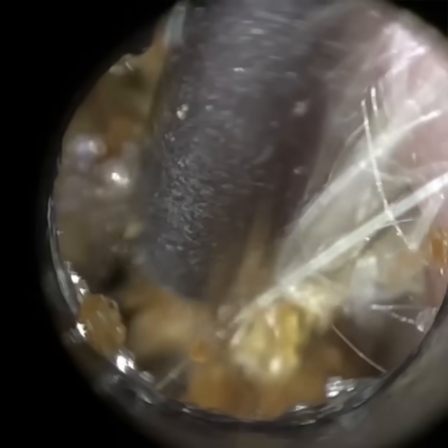And when the plug is adhered and attached to the canal, it's a tug of war. The canal doesn't want to let go of it, and it's up to us to kind of separate. So you can see I'm working all the way around the edge. You've got this fresher layer of dead skin that's lining the periphery of this plug. So if you can separate that, actually it helps you to remove the main plug, because it's that outer layer which is, it's almost acting like double-sided sticky tape. It's attached to the keratin plug, but it's still also attached to the canal wall.